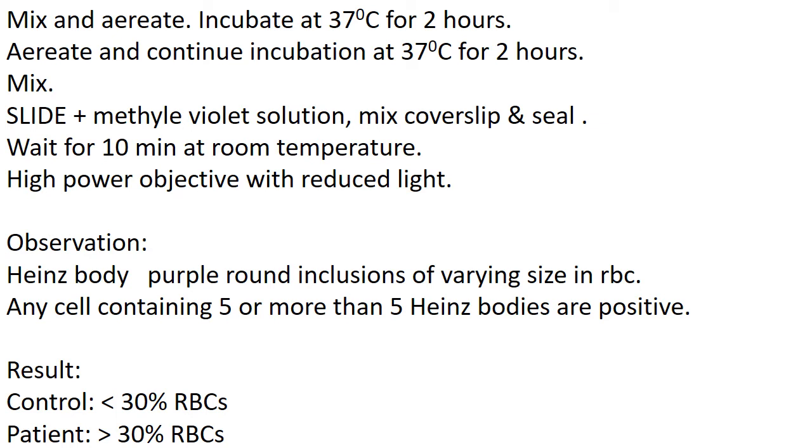Mix. Place 4 drops of methyl violet solution on a clean microscope slide. Add 1 drop of the blood preparation and mix it. Place a cover slip and ring the edges with Vaseline or any other sealing agent. You can use paraffin wax, nail polish, etc. to seal. Stand at room temperature for about 10 minutes.